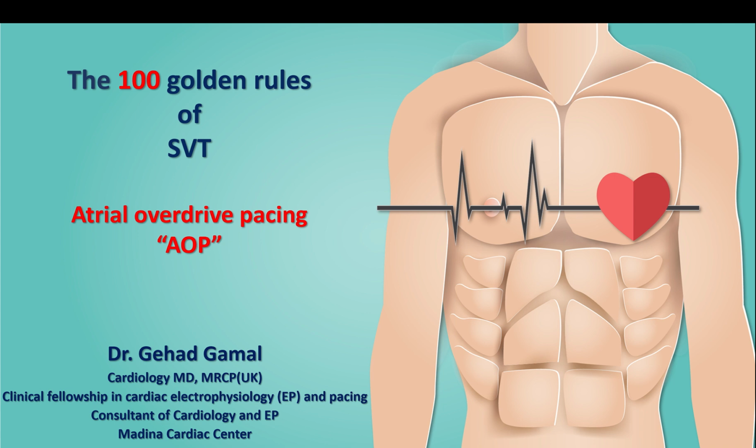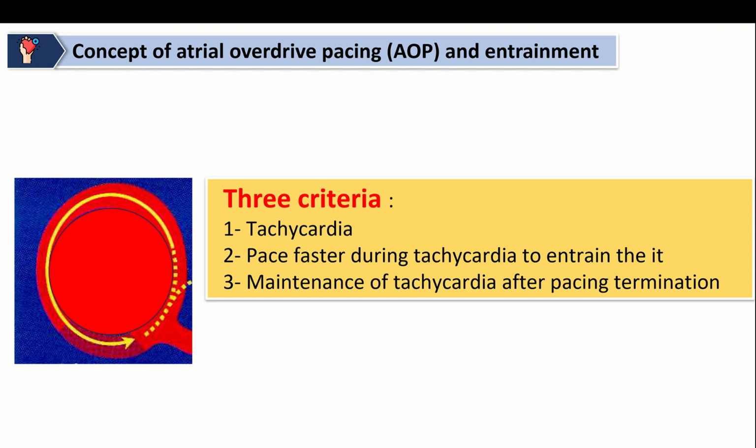Today I'm going to tell about the atrial overdrive pacing, one of the most important, powerful diagnostic maneuvers to reach the diagnosis, and how can we use it to differentiate all types. Let's start our lecture to tell about the main concept of the overdrive pacing. Today we will discuss the overdrive pacing from the atrium. How can we do the atrial overdrive pacing and entrainment?